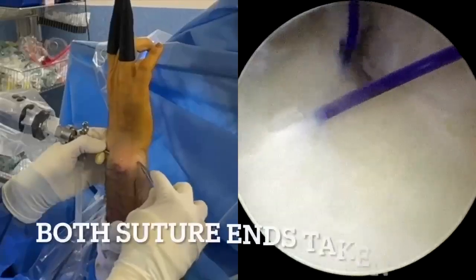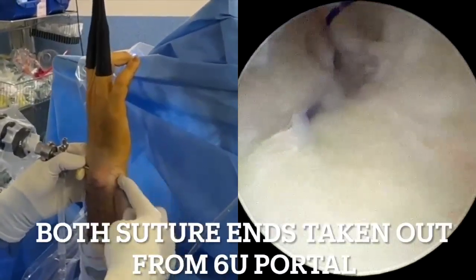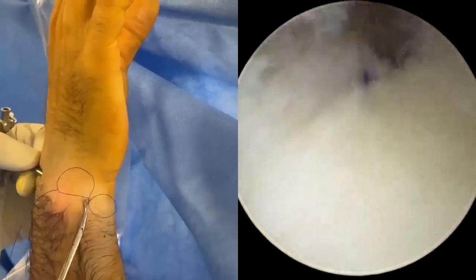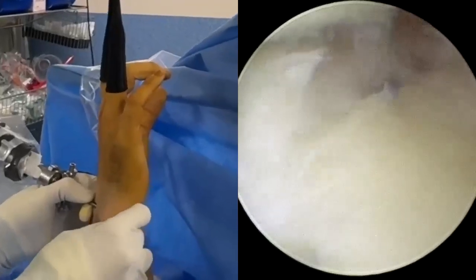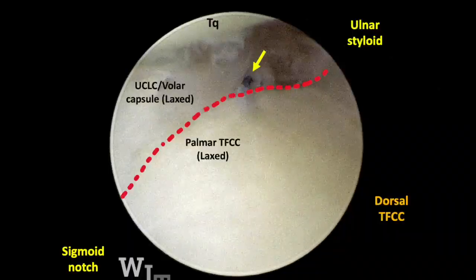The other end of the 3-O PDS suture is directly retrieved from the 6-U portal. It is crucial to ensure no soft tissue entrapments within the sutures. This is how the TFCC and ulnar carpal ligament capsule look before and after traction of the sutures.